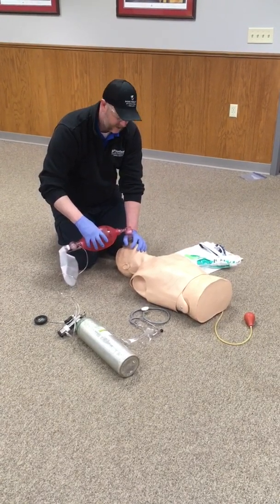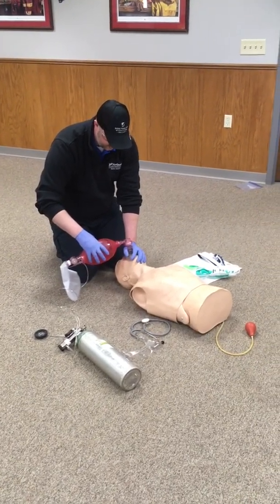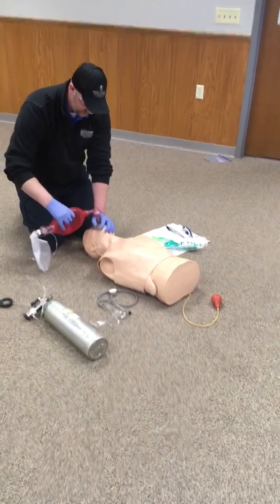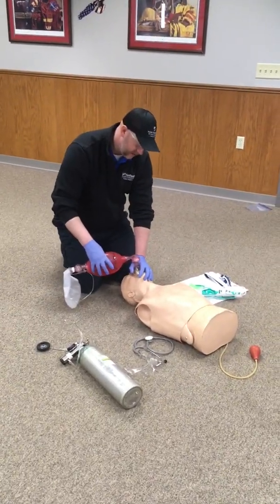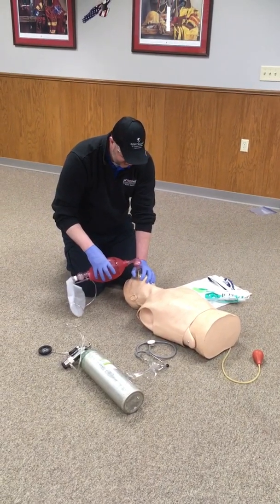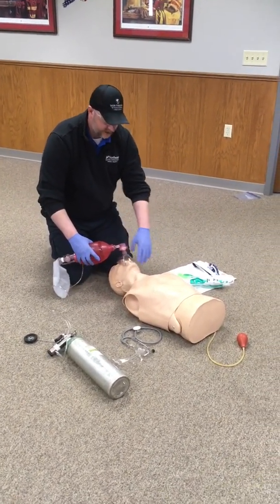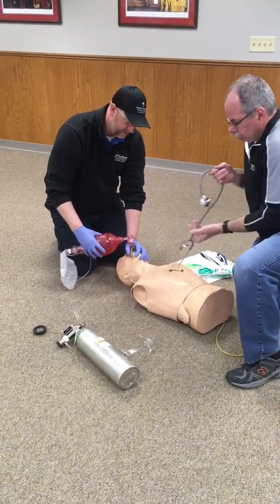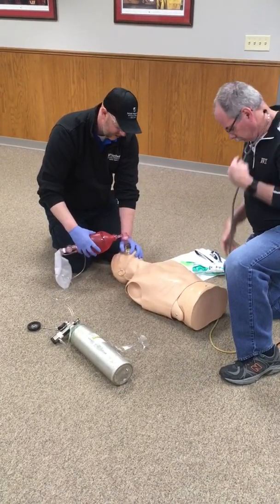With every ventilation, make sure that you're watching for adequate chest rise — we want to see that chest just start to rise. After about a total of a minute of ventilating the patient, the examiner is going to take their stethoscope and listen to the lung sounds and say that lung sounds are present, equal and bilateral, and medical control orders the insertion of an advanced airway or a supraglottic airway.